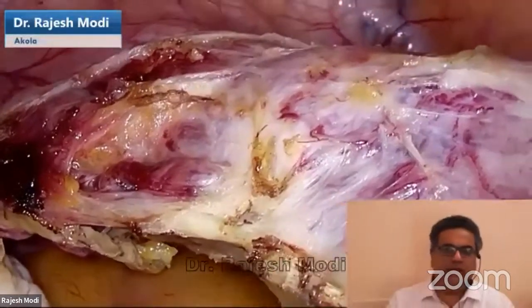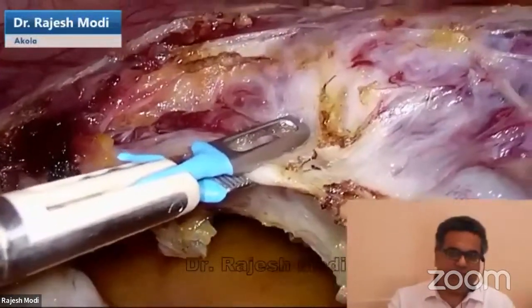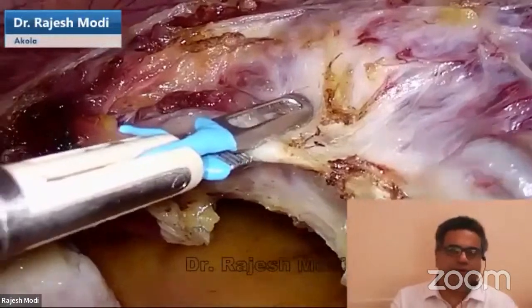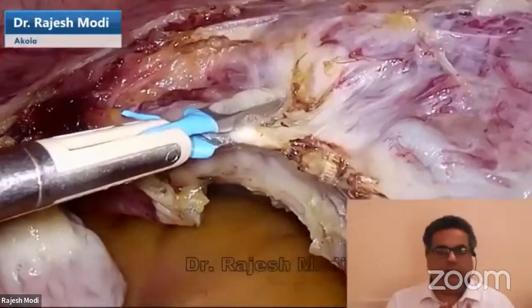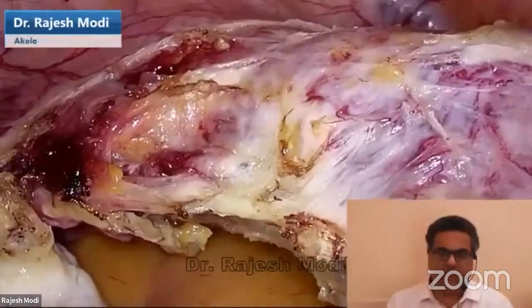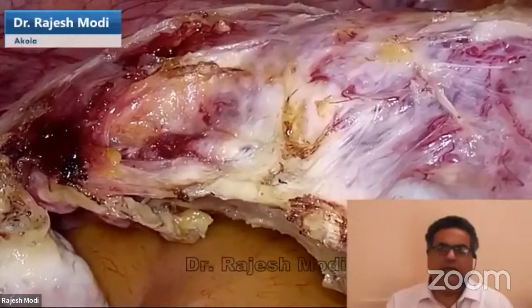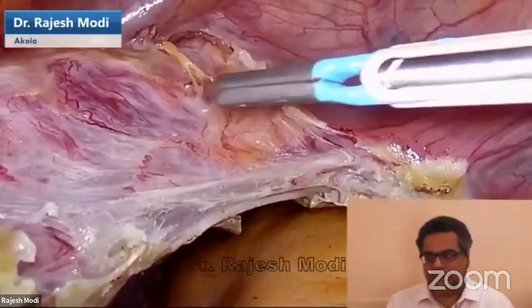What we have coagulated is at the level of the UV fold. The lower portion we are not touching, we are not coagulating. Where the UV fold has been cut is the level where the uterine has to be cut off. Once you understand the vessels, once you understand the artery and the vein and the bleeding which comes from those areas, your ability to do a hysterectomy improves significantly.